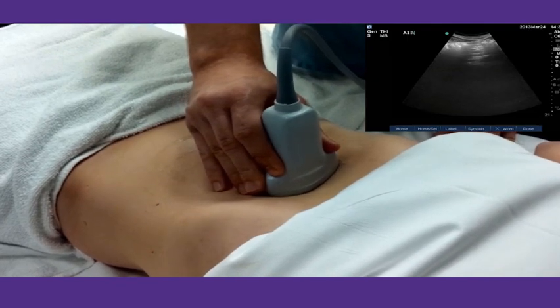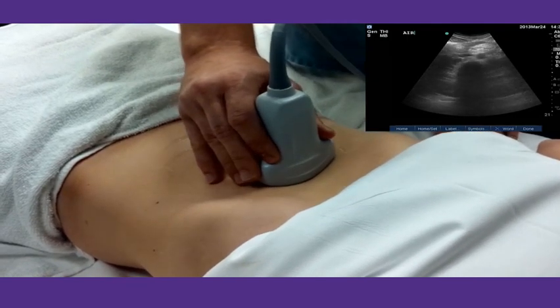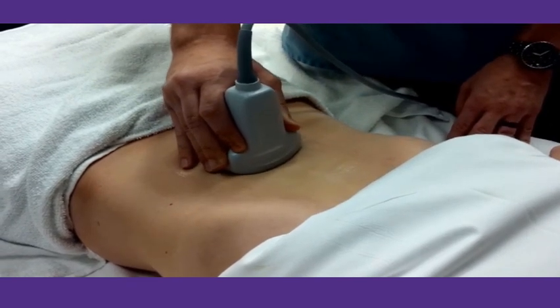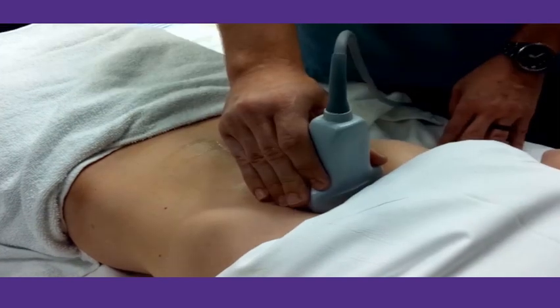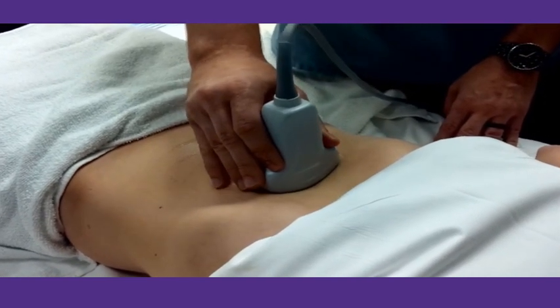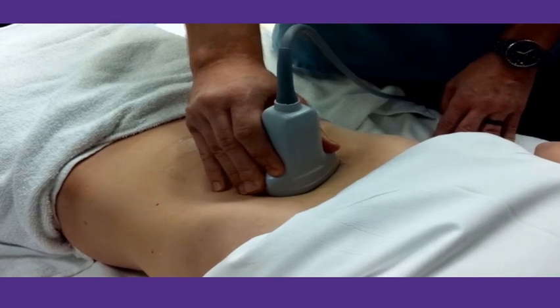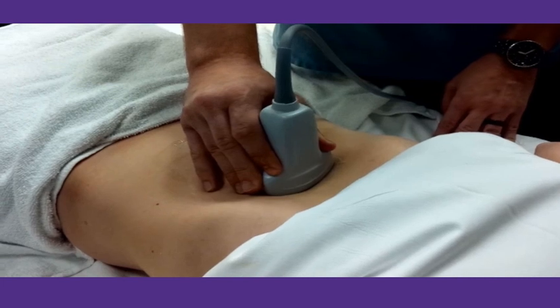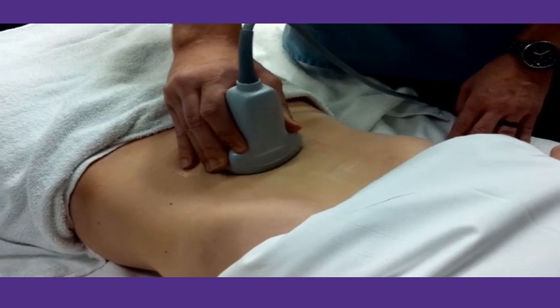If not, asking the patient to exhale fully and follow their loosening abdominal muscles with firm pressure on your probe, you may get a glimpse of the aorta. Again, if successful, attempt to get to the bifurcation with good visualization before the patient takes their next breath. By combining these techniques, it is usually possible to salvage several scans which would otherwise be abandoned as indeterminate.